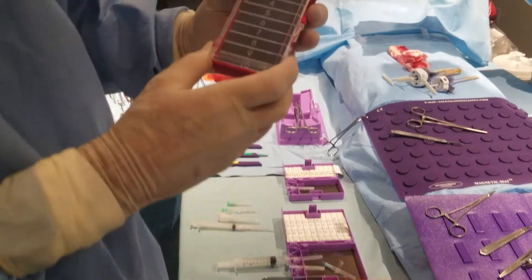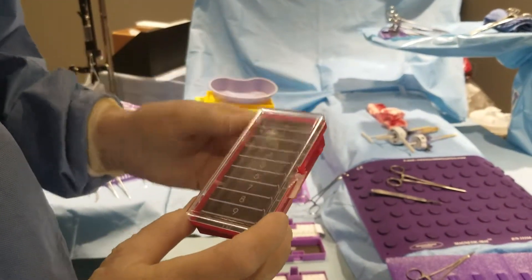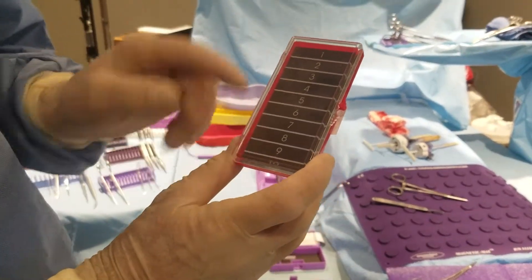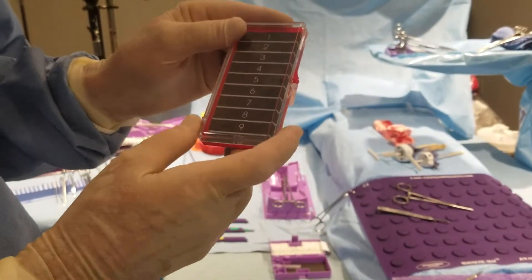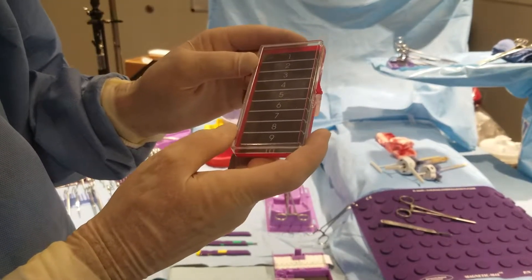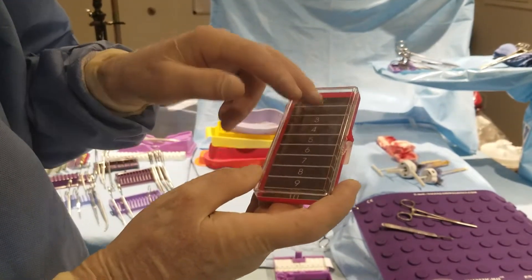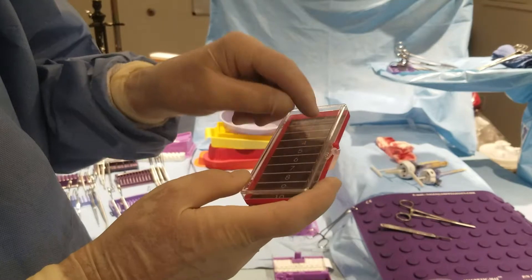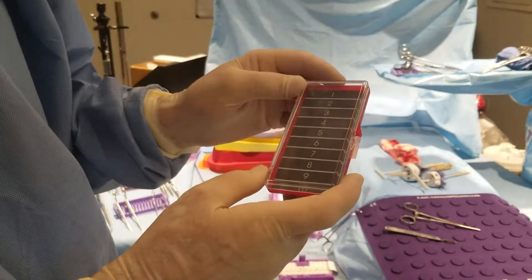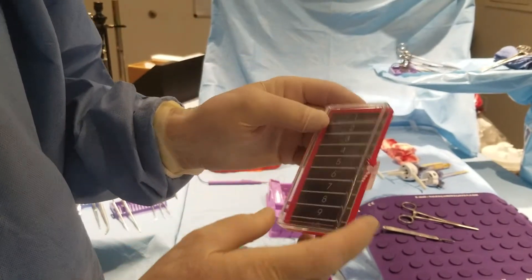The first one was a clear top with a red bottom and a magnet with 10 numbers. Originally, this box was used for eyeshadows for women. They had five different colors of eyeshadows inside the box and a brush, and the woman would buy it and put eyeshadows in as a cosmetic device.